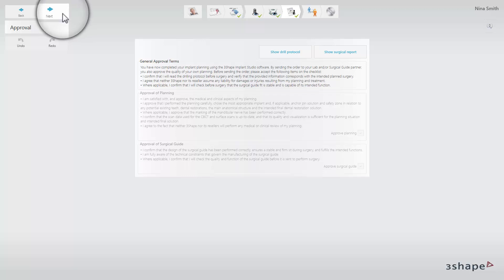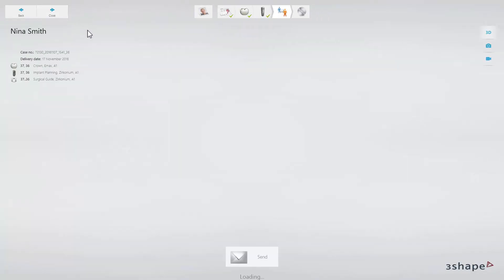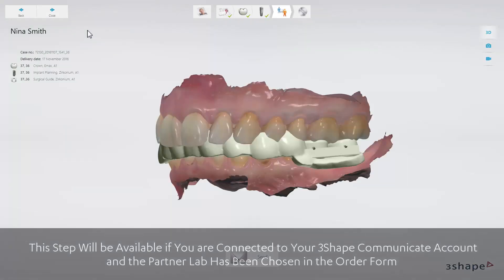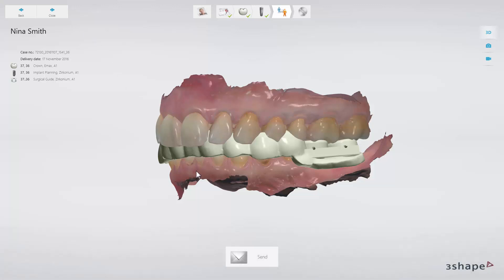Click Next to move on to the Send step. On the Communicate page, you can send your case to the partner you specified in the beginning of the case setup. To do that, click the Send button.